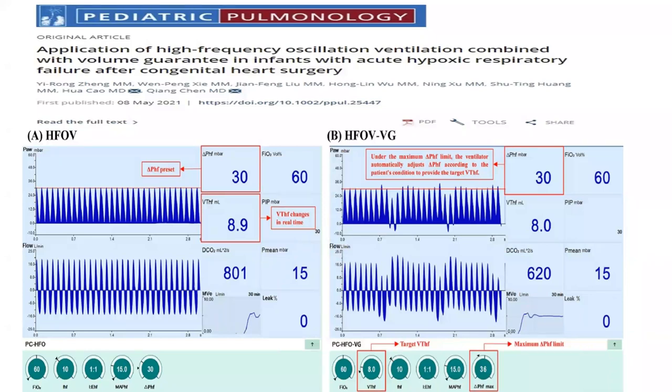In adults, it's used for respiratory distress syndrome, with a good predictor and good outcome. In pediatric cardiac ICU, people still haven't grasped all the concepts and are still afraid of the hemodynamics. That's why we are inviting these lectures to be done, to teach and educate people about that. This is the first comment.